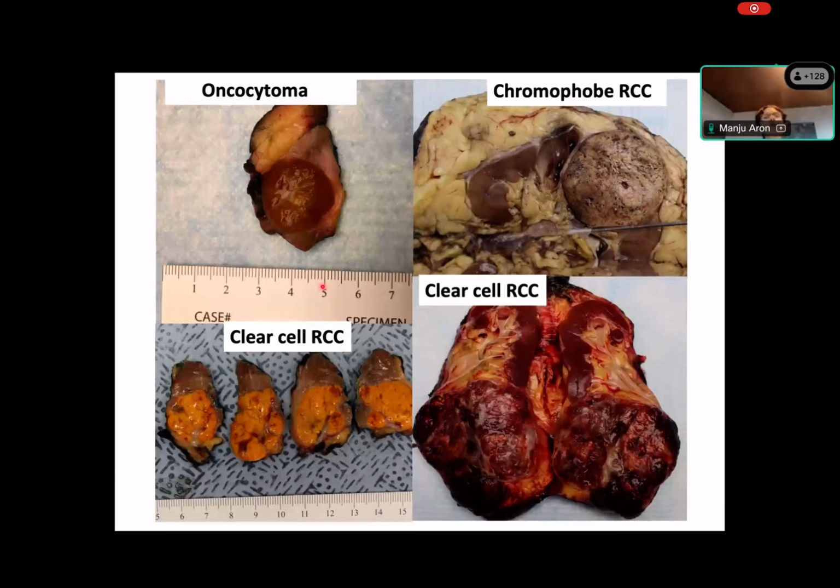So these are important because the brown mahogany color tumor is an oncocytoma. Tumors which look paler than the normal renal parenchyma are usually chromophobe RCCs. And clear cell RCC, as you know, textbook appearance is that golden yellow color, but they can also be very heterogeneous in appearance, as you can see in this large tumor, where you can see a lot of hemorrhage within this tumor. So they can have a very variegated appearance too.